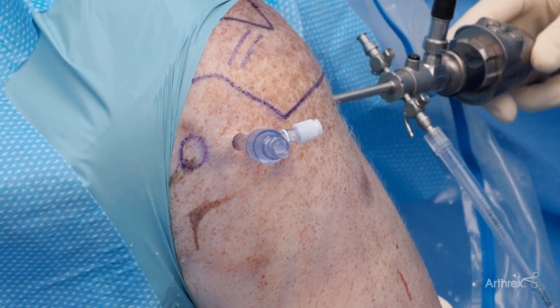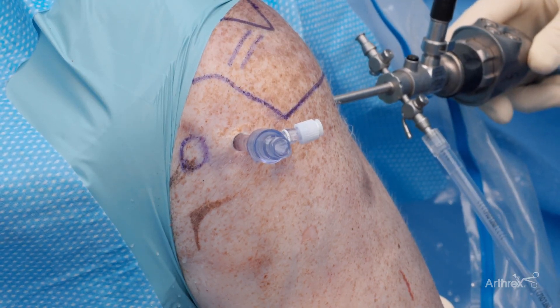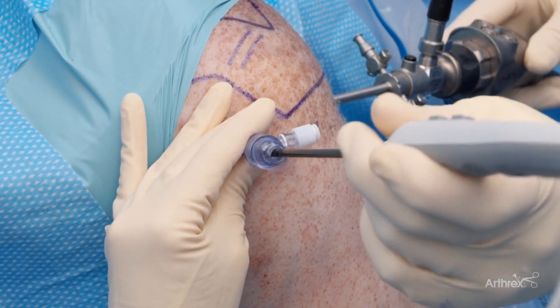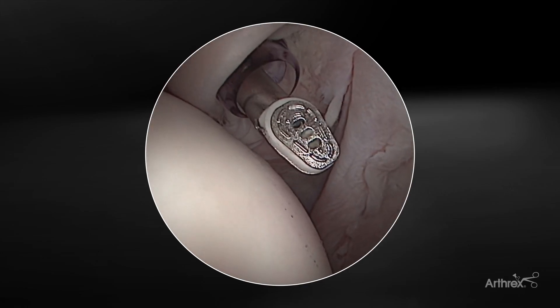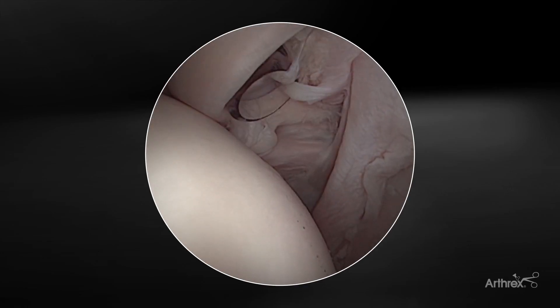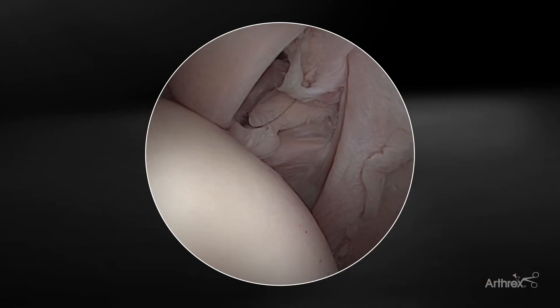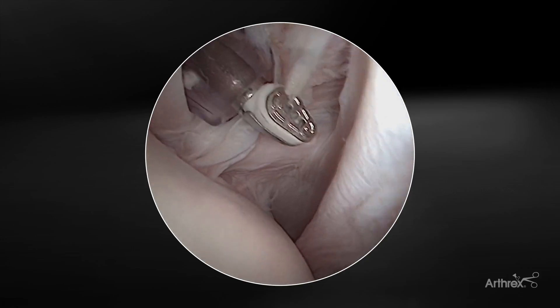Darren Friedman, sports medicine physician out of New York City. We're here today to discuss the latest addition to the Apollo portfolio, the i90. I'm going to introduce the i90 into the anterior rotator interval portal. You can see, due to the torpedo-shaped electrode, the ease of insertion in and out of the portal, in and out of the joint. This device also easily fits through a five millimeter cannula as well.